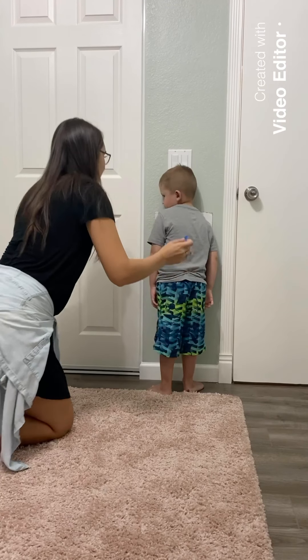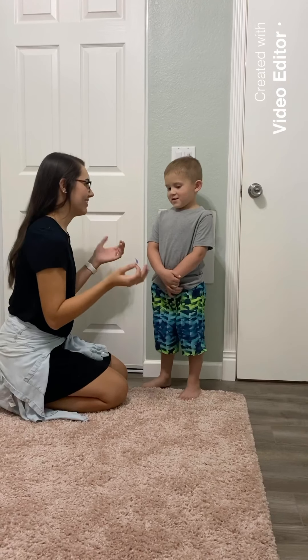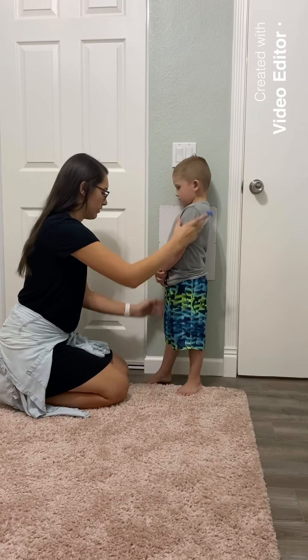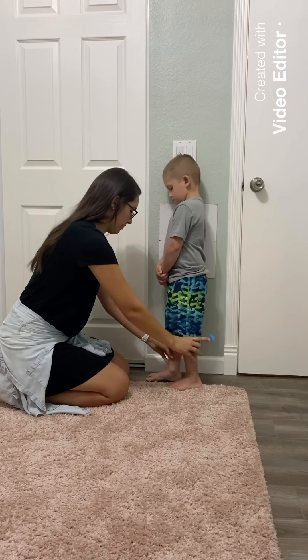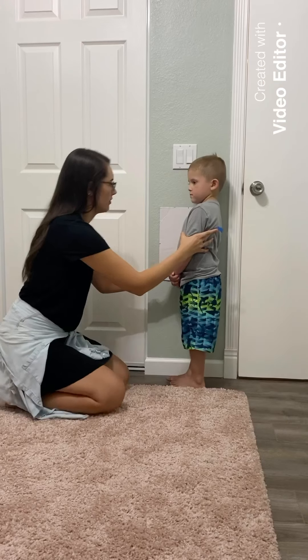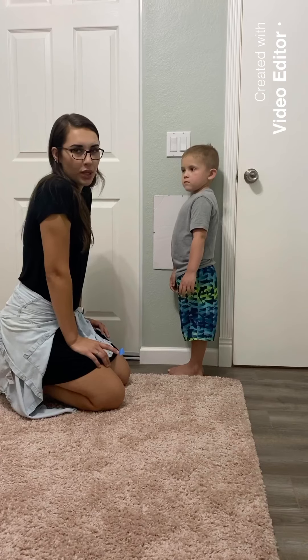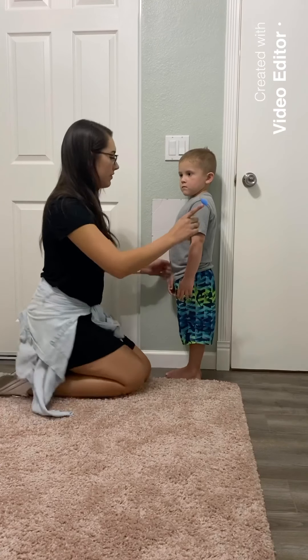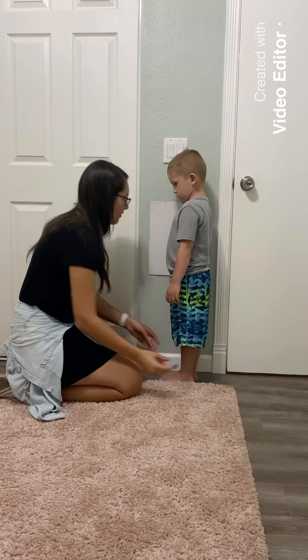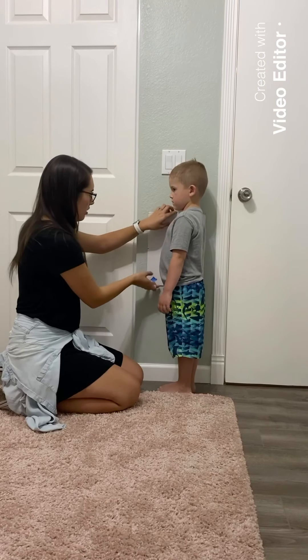Okay, now you can face me. Look at me now. Why did you take the tape off me? Because that was just a pretend picture, okay? So this time, put this side right here. Can you turn your feet too? Put your feet together. There you go. And take a little step back. Okay, my alarm went off so it stopped the video — I'm going to keep going. So for this one, just stand right here, stand straight and put your feet straight. The IR is going to be an inch and a half above.